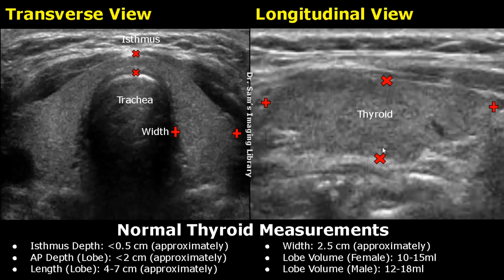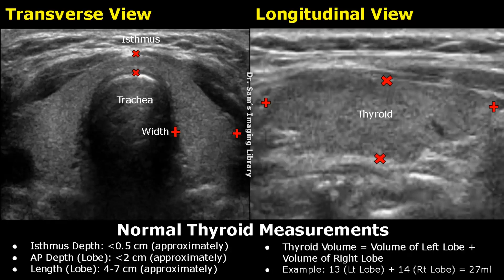After taking all these measurements, we can measure the volume of the thyroid lobe. The volume of each lobe is between 10 to 15 ml in females and 12 to 18 ml in males. This is the volume of only one thyroid lobe. To get the total thyroid volume, we will add the volumes of both the thyroid lobes.